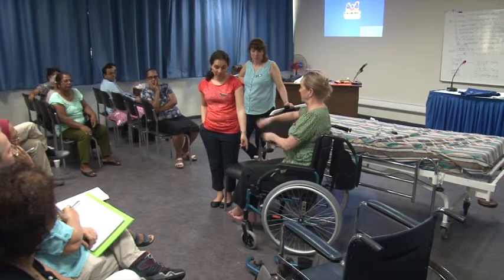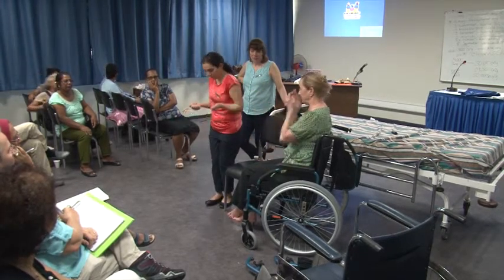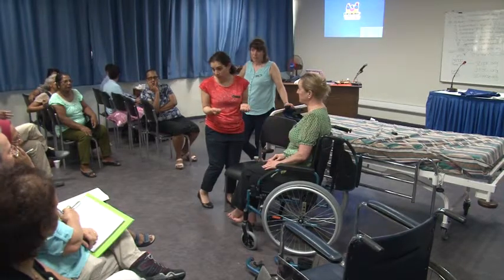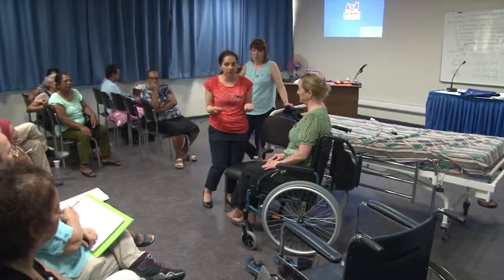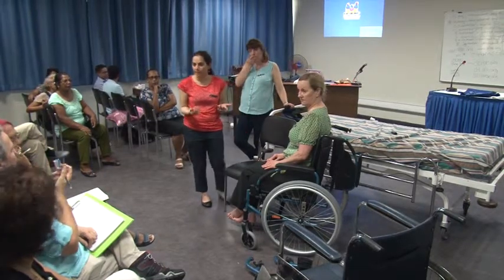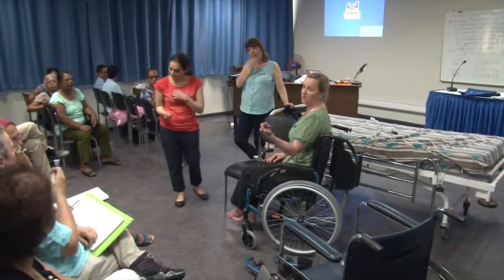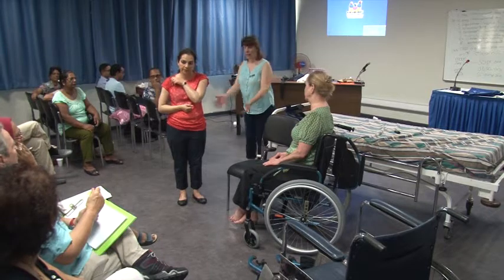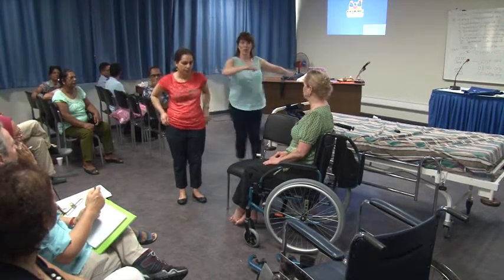That's what we did with some of our patients. We had to kind of get them off the surface and do a pivot, which is a very specialist one. This was not a platform system because it's a risky one and anything can go wrong. We've used turning boards. Some people can do that. There are also little rotor stands you can hold on to. You stand and then rotor stand.